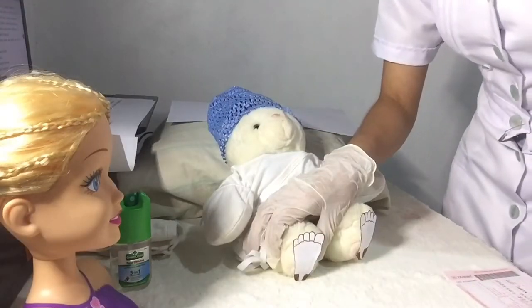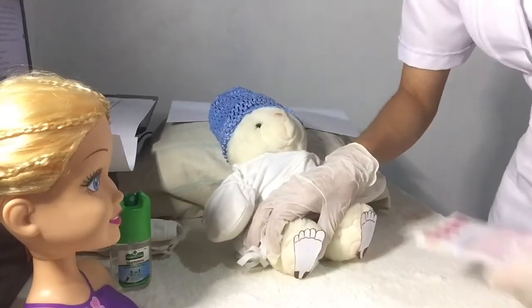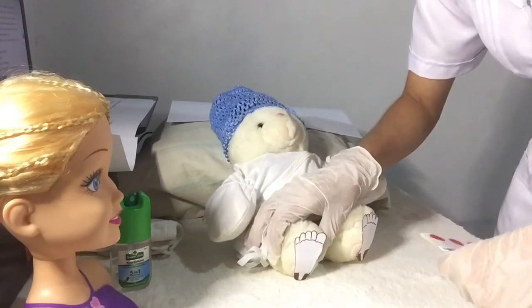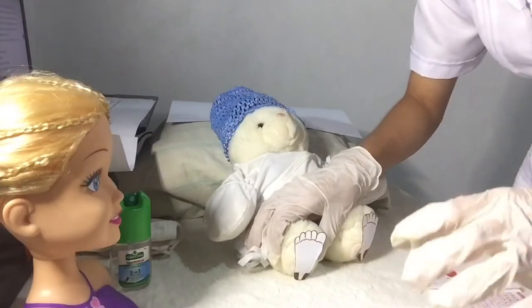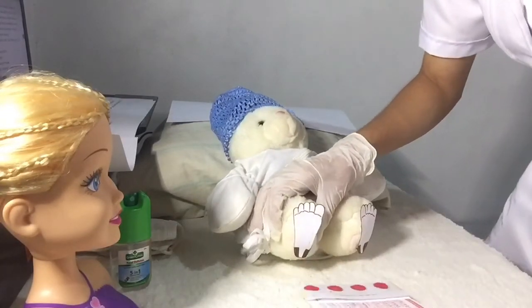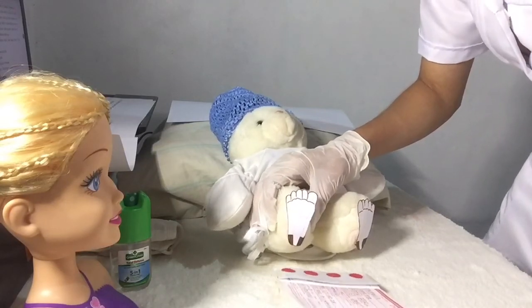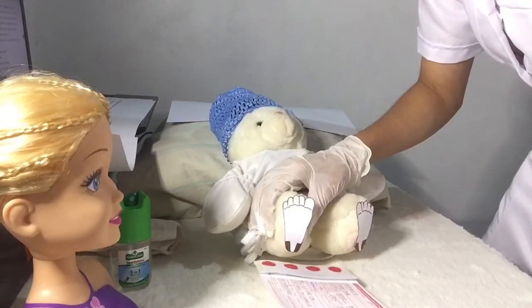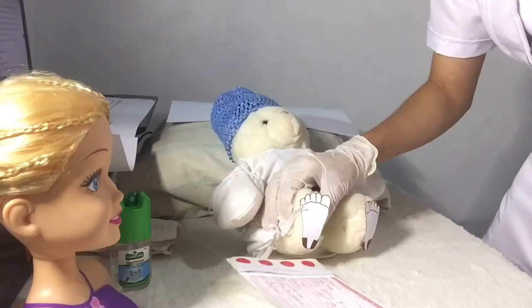So we have here our NBS specimen collection paper. So first, before blotching po, we have to accumulate the blood before blotching on the filter card so that po may enough blood before we blotch. And also, after that, we are going to touch the first circle of the newborn screening card gently against the large blood drop. We have to avoid layering, kasi the machine might not accept it. Okay?